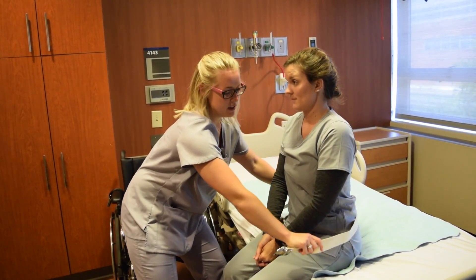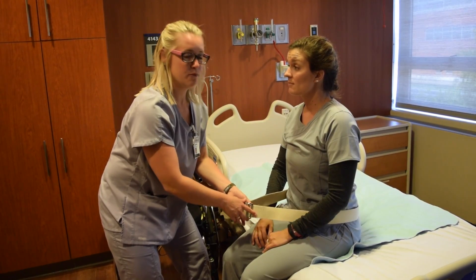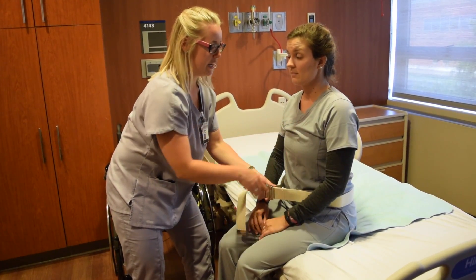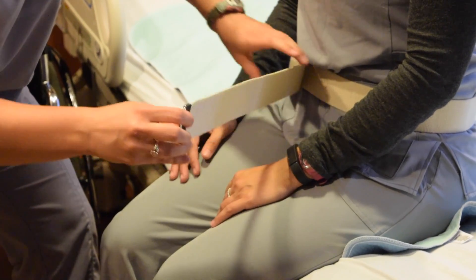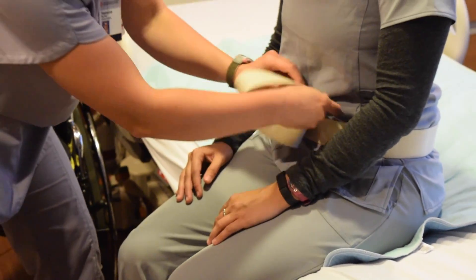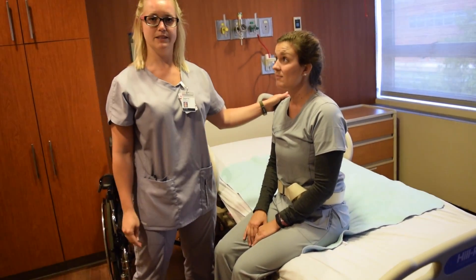You want to put the gait belt as low as possible. If the patient has tubes, lines, or any other medical concerns in the abdominal region, you can place the gait belt higher up. Cinch the gait belt as tight as you can to the point where you can only put two fingers in the gait belt. You can then tuck the rest of the belt into the gait belt to avoid loose ends.